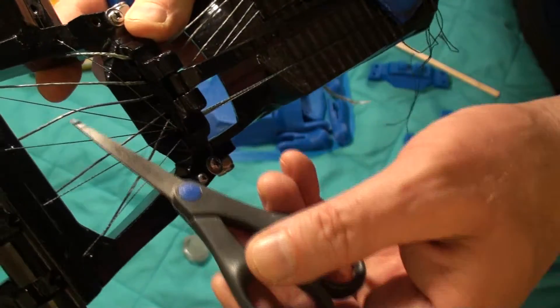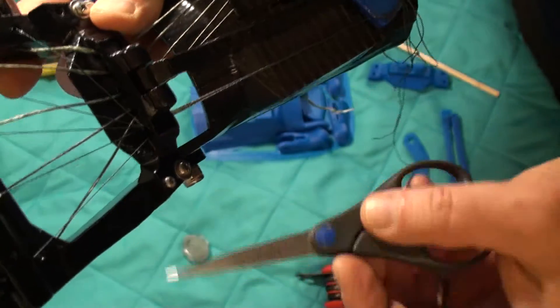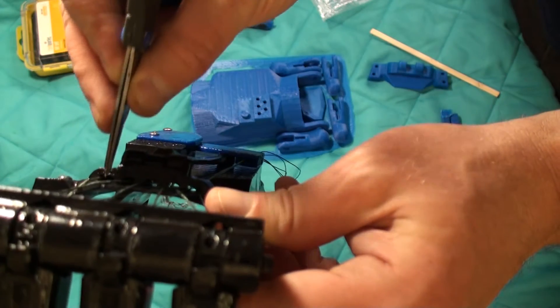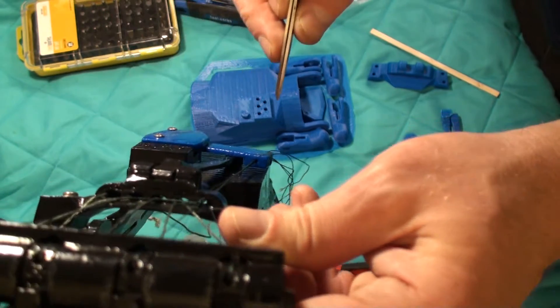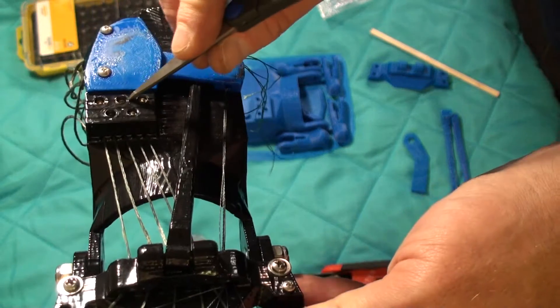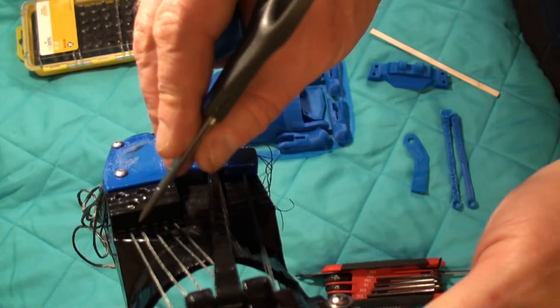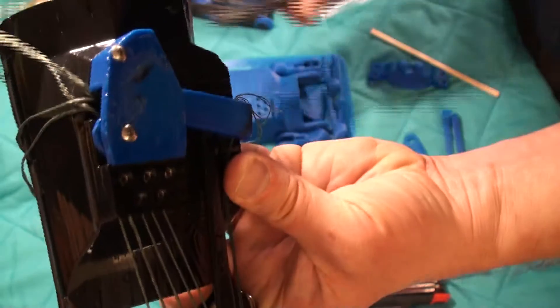I'm using the middle finger flexor, although all the flexors run pretty much the same way. Each flexor goes through its hole here — this is for the thumb flexor, this is the index, and here's the middle finger flexor which is the one we're following. They all come out and go into this block here. You can see the front of the block where these five cables are going in, and they actually thread all the way through and come out inside here.